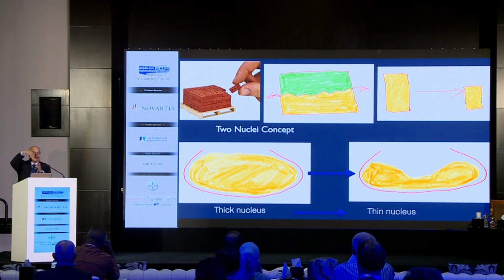So you are not seeing deep enough. And if you're not seeing well, you are afraid, so you try to fracture, and this is what I think is a wrong nomenclature, saying gummy nucleus. There is nothing called gummy nucleus. It is that you did not go deep enough to crack the nucleus.